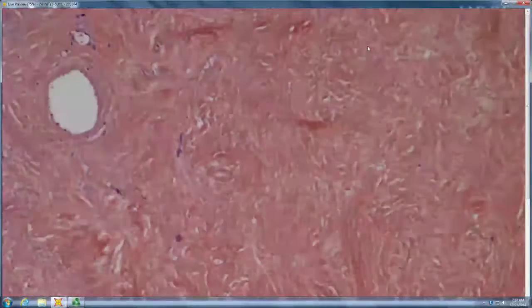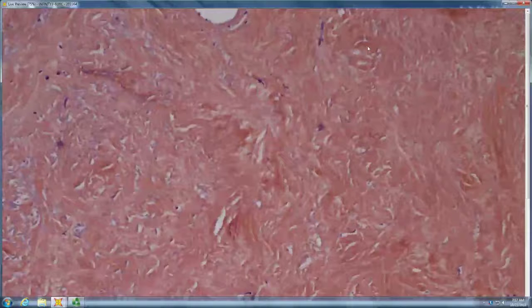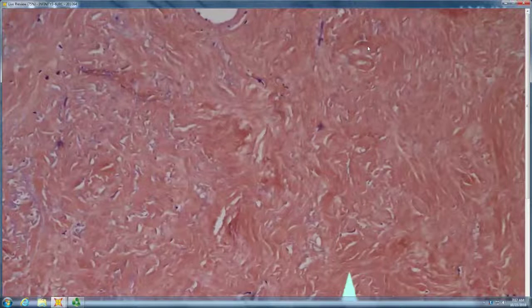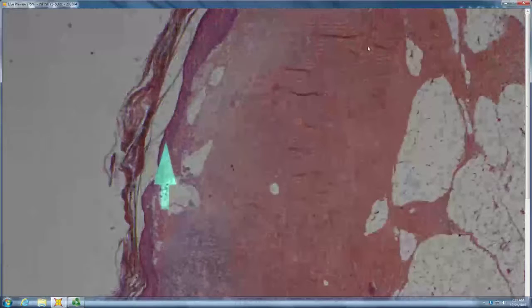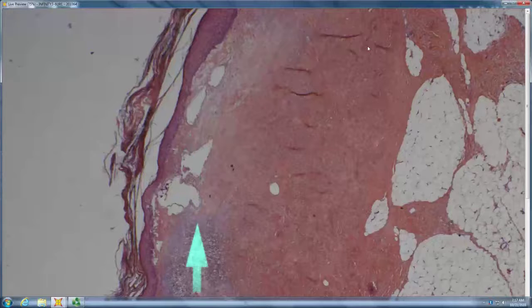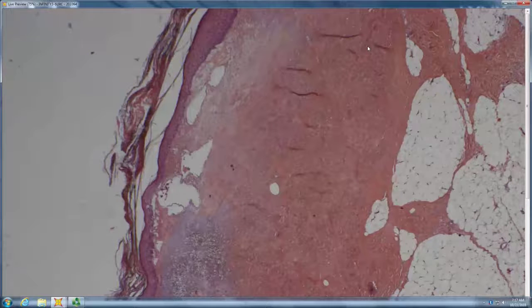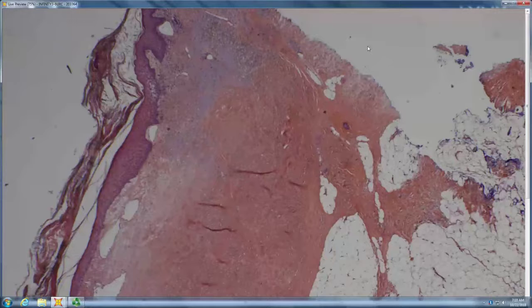And if we go a little higher, exactly, you have very large stellate, irregular fibroblasts that are good for radiation fibroblasts. So this is radiation dermatitis. To summarize again: hyperkeratosis, alternating atrophy and acanthosis of the epidermis, homogenization of the superficial dermis, prominent elastosis that looks like solar elastosis, except that it also extends down hair follicles, loss of adnexal structures, and presence of radiation fibroblasts. So how would it differ from superficial morphea?